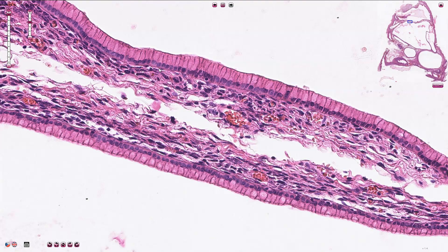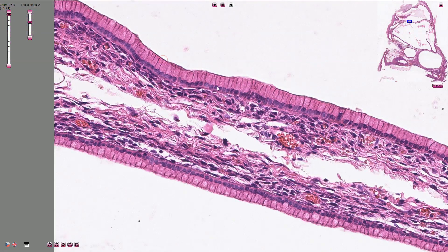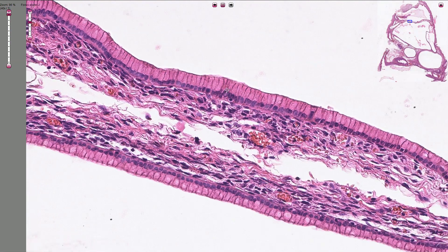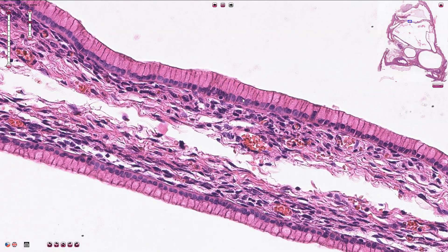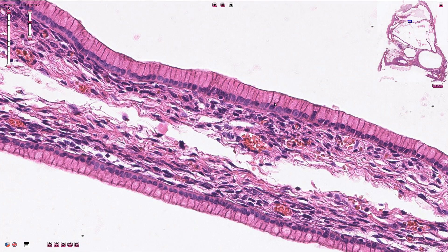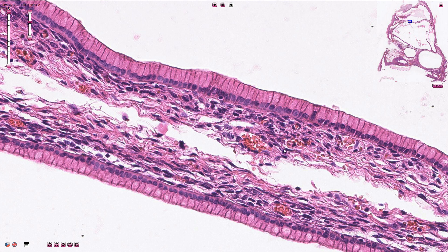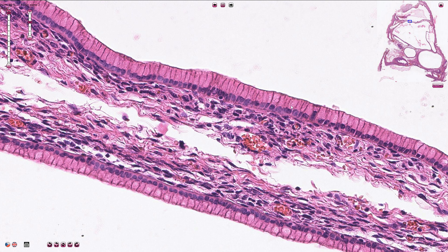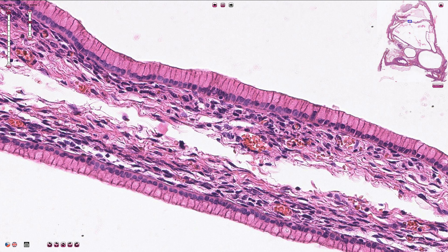On higher magnification we can see that the epithelium consists of uniform benign-looking cells with basally located nuclei and quite voluminous cytoplasm. The cytoplasm contains a lot of mucin and therefore the appearance is slightly eosinophilic to clear.